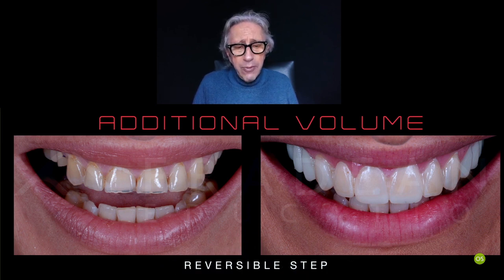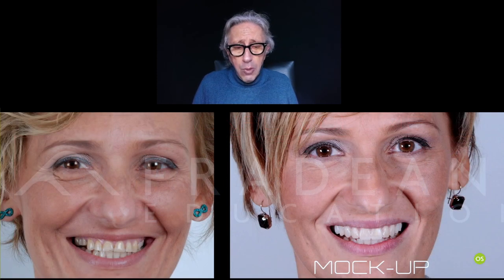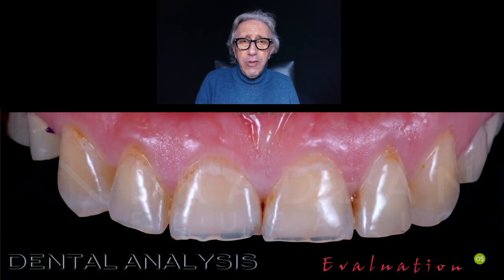As you know, the mock-up is a reversible step. It means that you can say, I would like to go ahead, or you don't want to go ahead because you don't like it, so you can remove it in 5 minutes. No problem at all. But a preview without touching the teeth is a great tool. And in this way, you can show the patient the improvement. The patient will be happy, and you can at this point share and go through to the final work. So having tested with the mock-up, and proved that this is the position we want to achieve, at this point you can copy it to the final work.